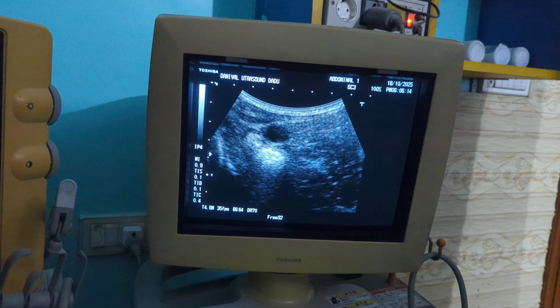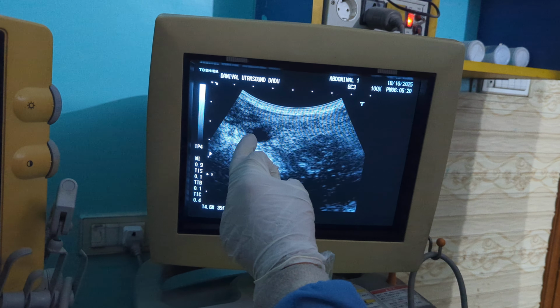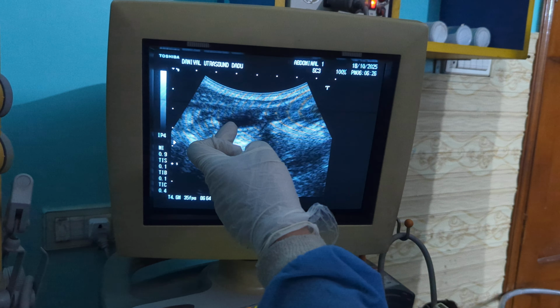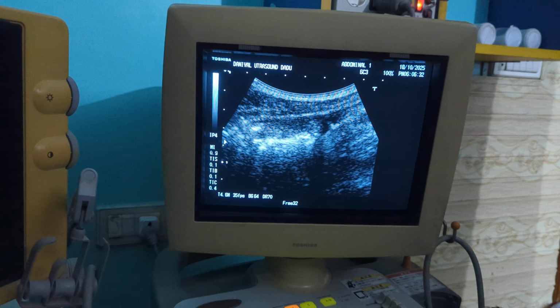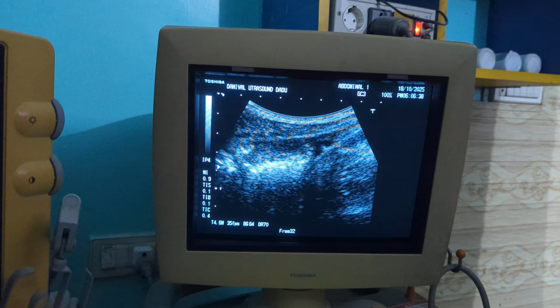This is the transverse section I show you. This is like a cystic space in transverse section, and when we take its longitudinal section, it's an elongated sausage-shaped or tubular structure which is containing these foci. So this was an interesting case. That's why I wanted to share this.